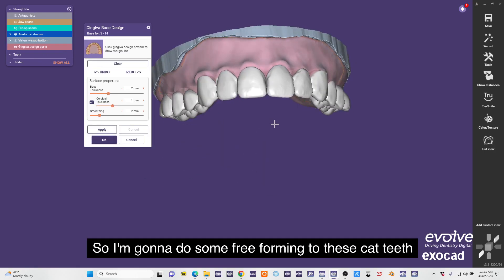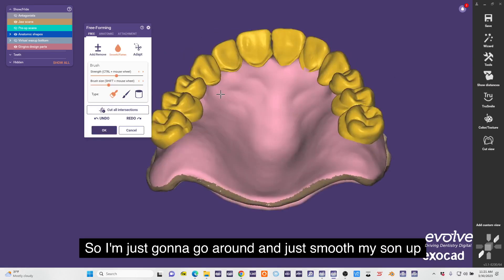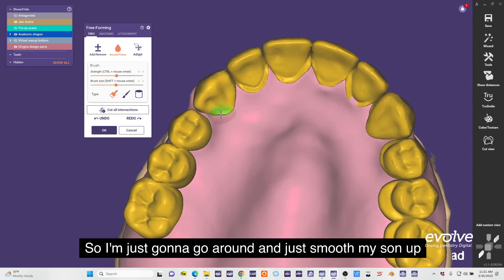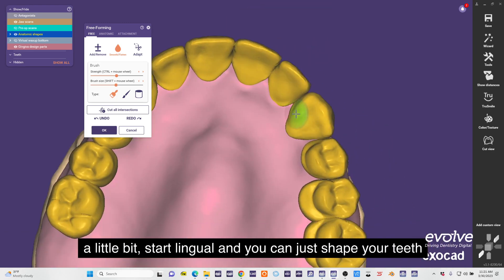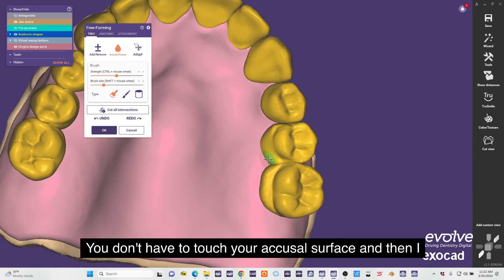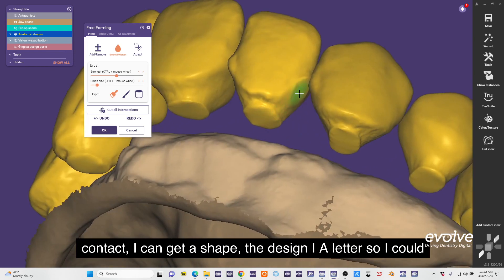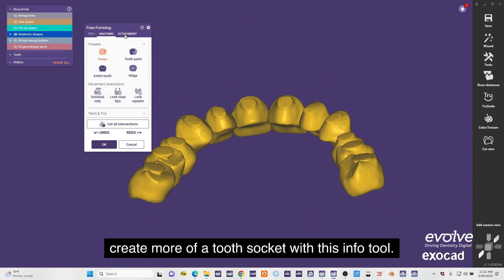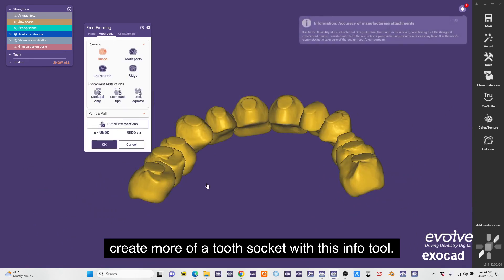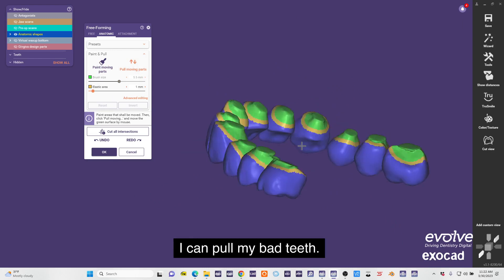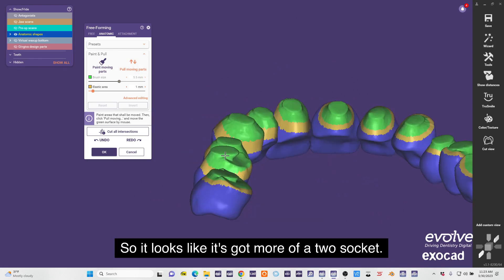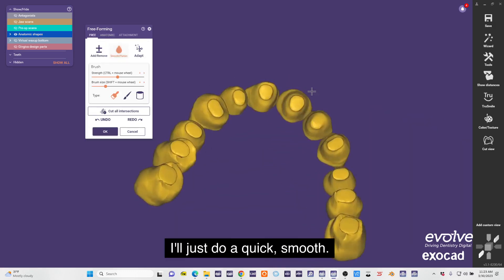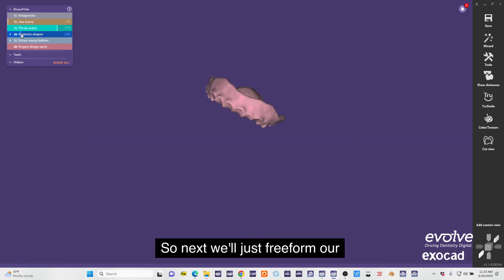I'm going to do some free-forming to these CAD teeth because I think it could look a little nicer. I'm just going to go around and just smooth my setup a little bit, start lingual. You can just shape your teeth a little bit better - you don't have to touch your occlusal surface. Then our contacts, I can kind of shape the design of the teeth. I could create more of a tooth socket with this pull tool. I just do this and pull up - I can pull my CAD teeth so it looks like it's got more of a tooth socket. Nice, I'll just do a quick smooth, awesome.